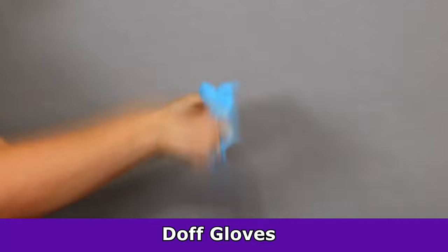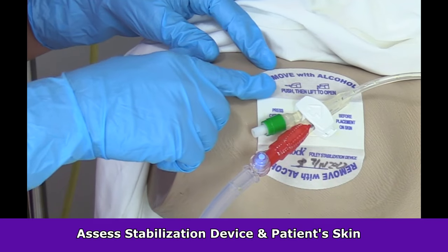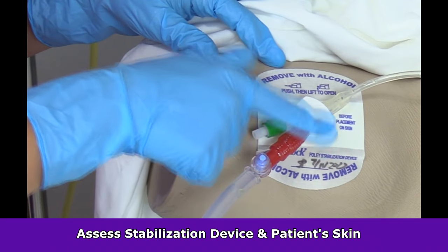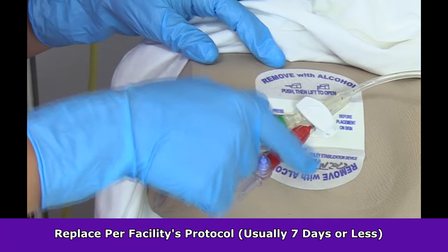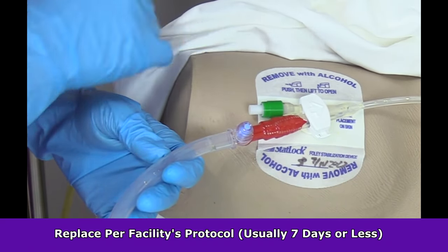Now let's doff our gloves, perform hand hygiene, and place the Foley catheter back into its securement device. And before you place the catheter back in its securement device, assess the device. Make sure it's clean and it's still working and that it doesn't need to be replaced with a new one. And check the date of when the last securement device was placed onto the skin. With these StatLock devices, you usually want to replace them every 7 days, whatever your facility's protocol is.